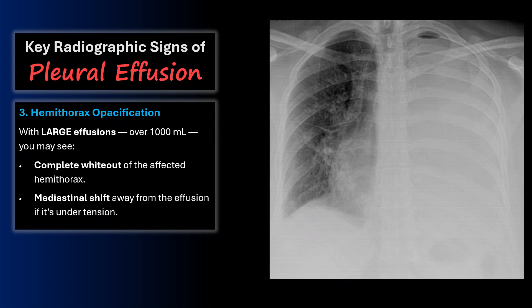Third, you may see opacification of the hemithorax. With a large effusion — over a thousand milliliters — you may see complete white-out of the affected hemithorax, and sometimes a mediastinal shift away from the effusion if it's under tension.